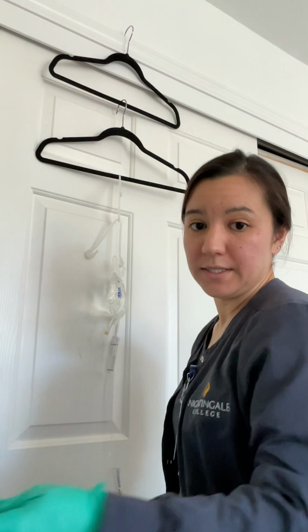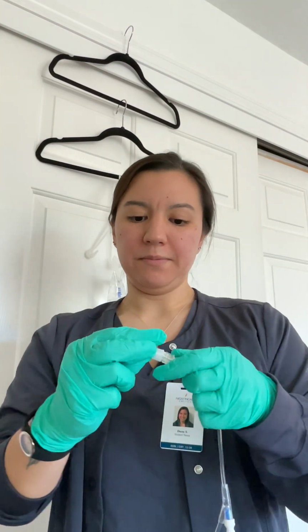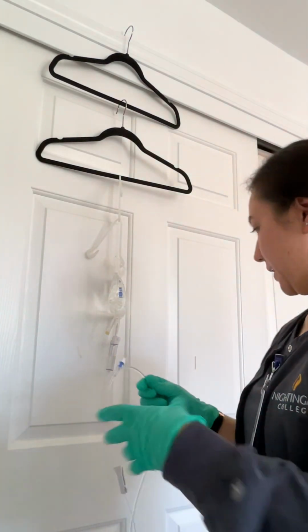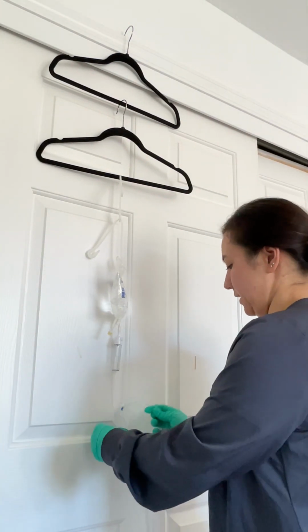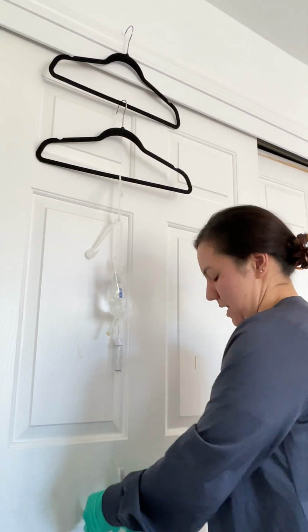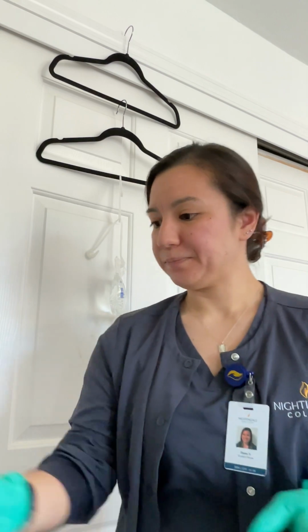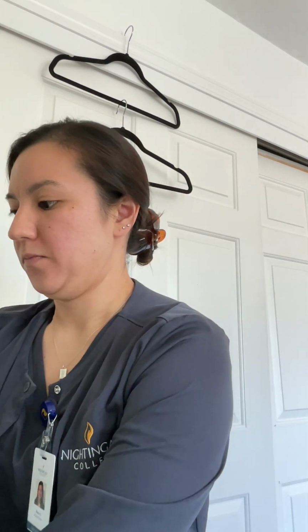Alrighty, so that one is done. I'm going to put the adapter end back covered. We're going to hold off on doing anything with this one. And now we are going to spike our medication bag. So I'm going to take this one off.